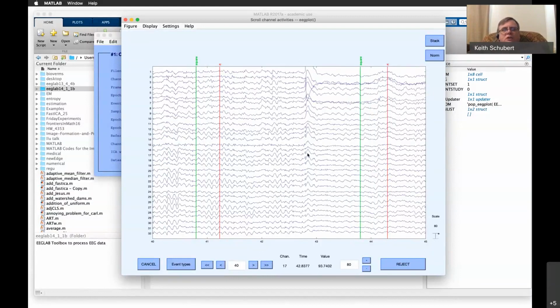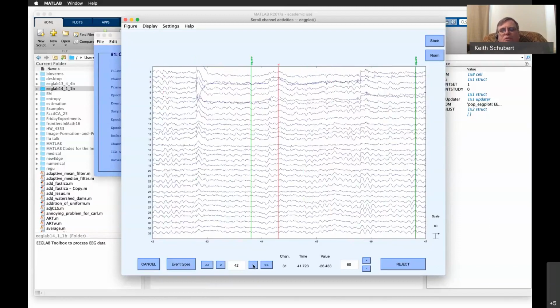Generally, the best way to remove blinks is not to try to filter them. It's to let ICA separate out a blink channel, and then you delete that channel. So we're looking through for those. We do see a little bit of a disconnection here that could cause some of this spiking. There might be some eye movement happening in this area, maybe for this particular one the square was in a different corner of the screen, so the person's eye had to drift or something.